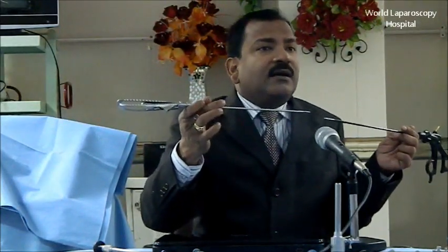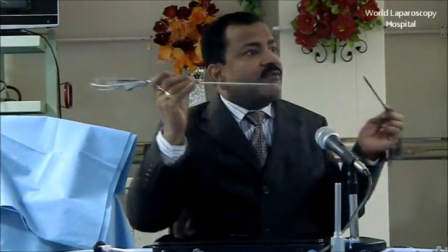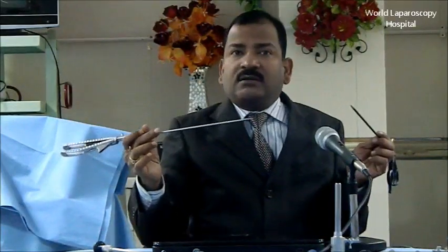Unless I sacrifice that port, I will put another. If I want to use it, now my manipulation angle is fixed, and throughout the surgery I am crying, I am struggling. And why was this? Because I did not know the principle of port position.